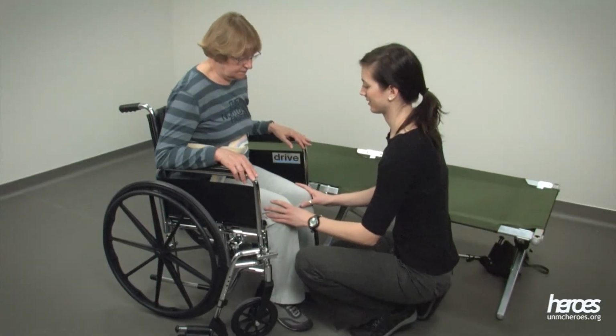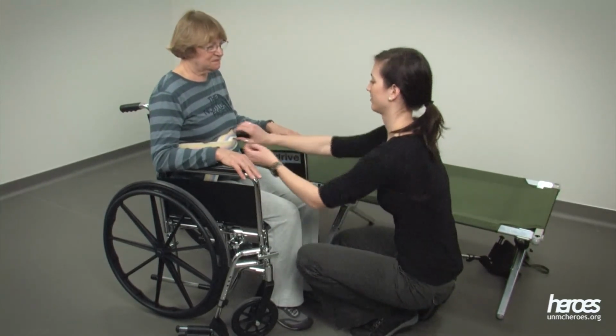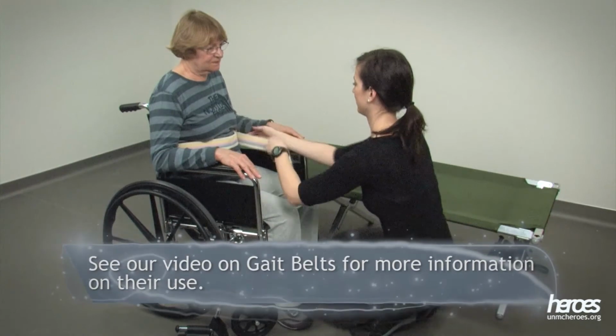As you help the individual lower to a sitting position on the wheelchair, you may still need to keep the weaker leg supported with your leg. If needed, help the individual scoot back in the wheelchair. After the individual feels comfortable, you can remove the gait belt from their waist.